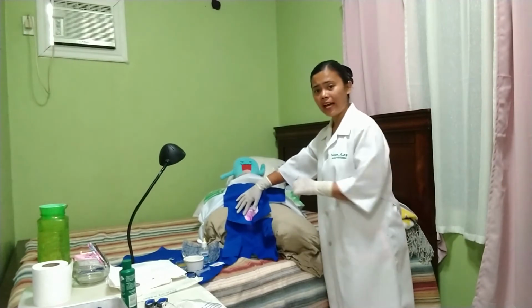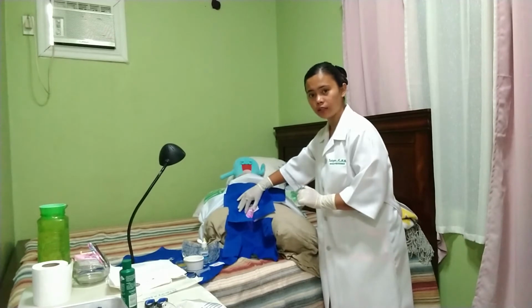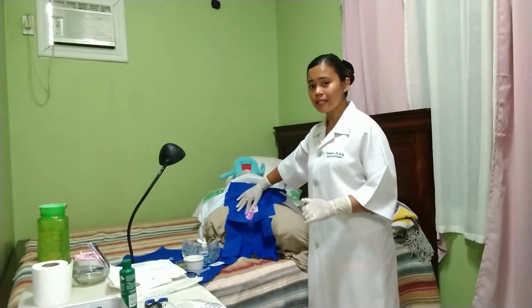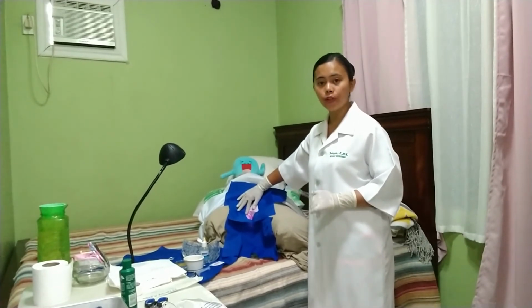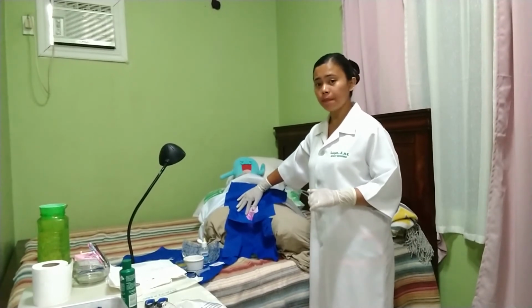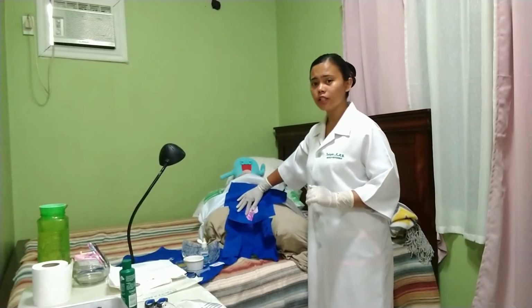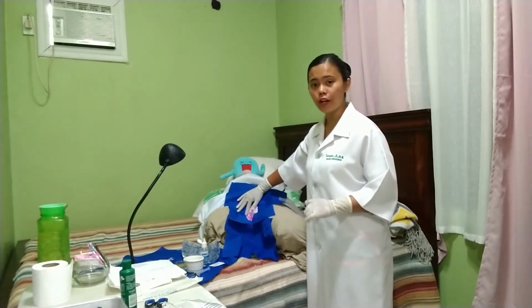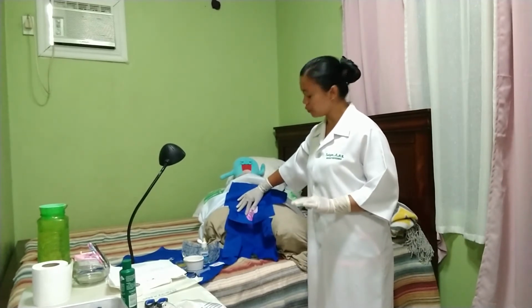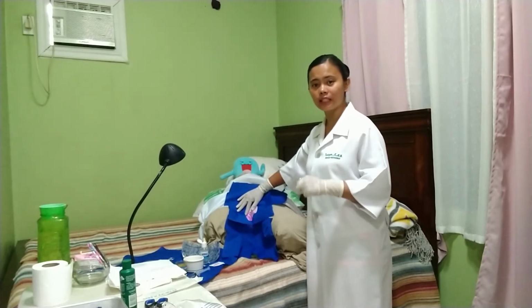Remember that we have to hold the position of our non-dominant hand throughout this procedure. Remember that for our male clients, we have to still use our non-dominant hand to reach over the hole of the fenestrated drape and to grab or hold the penis. If the male patient is uncircumcised, we have to retract the foreskin and continually hold that position during the procedure. If the foreskin slips back, then we have to clean it again.